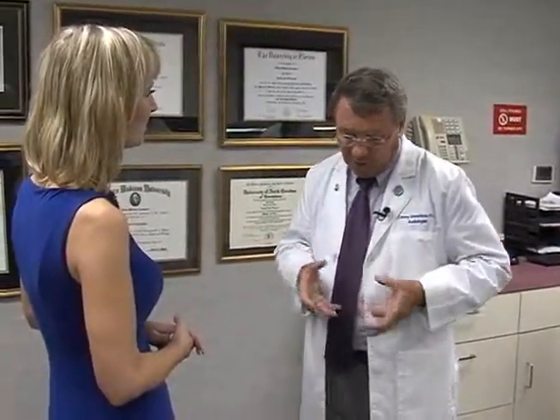When we figured that out, the next thing was the cow horn, and that's what Beethoven used. You know, he had a severe hearing impairment. And then as we got a little more sophisticated, we got into vacuum tubes in the 1900s, so the hearing aid was the size of a table. And then we got into transistors, and they were kind of like a box and got smaller and smaller until we got the very miniaturized printed circuits we have now, so that hearing aids are very, very tiny.